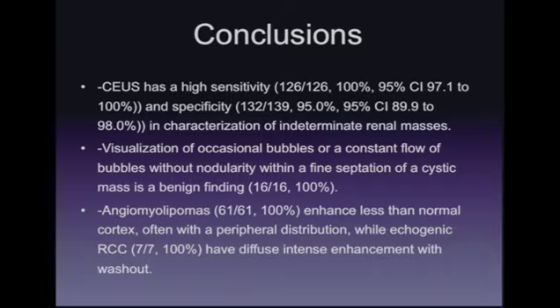So to conclude, ultrasound contrast has a high sensitivity, which is 100%, with confidence levels of 97 to 100% in our study. It had a very high specificity of 95%, with confidence levels of 90 to 98% in our study in characterizing indeterminate renal masses.